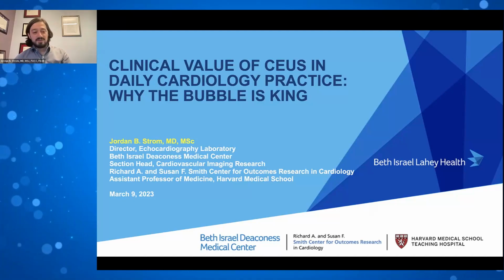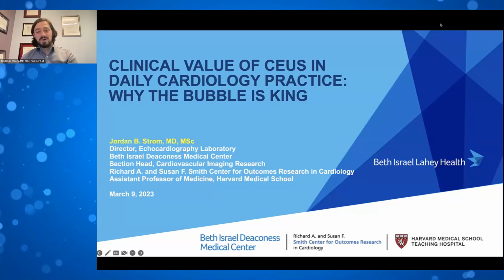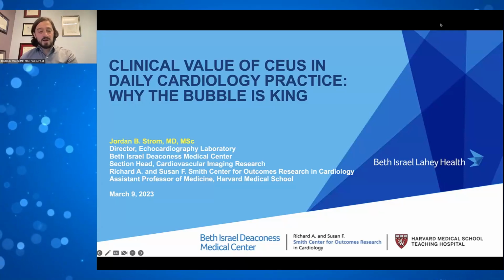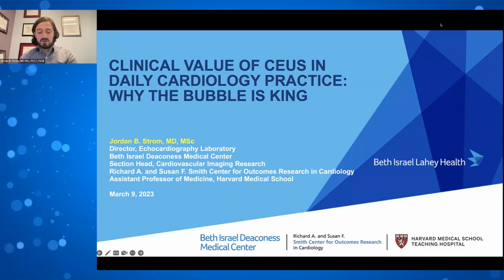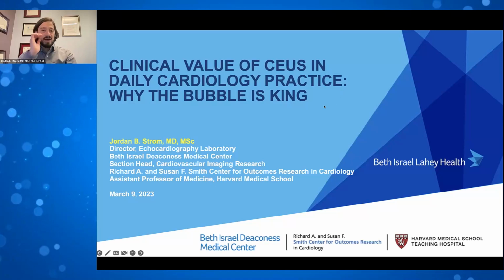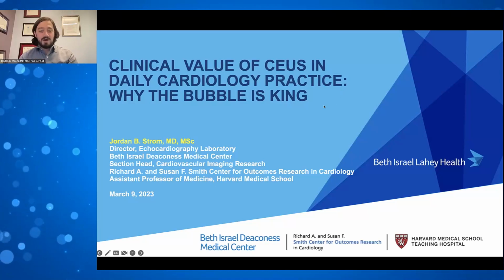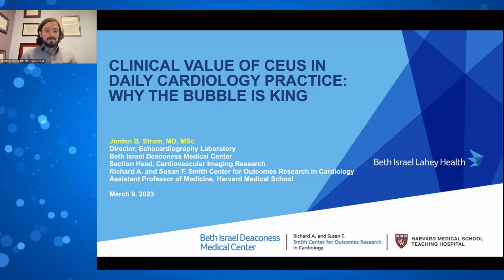Practices differ on a local basis, but this is quite a valuable technology, and it's something that sonographers are frequently trained to do and are within their wheelhouse. So with that in mind, I'm not necessarily the king, but I will tell you why Bubble is.